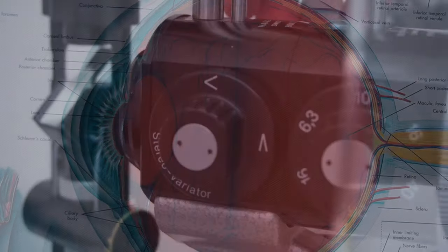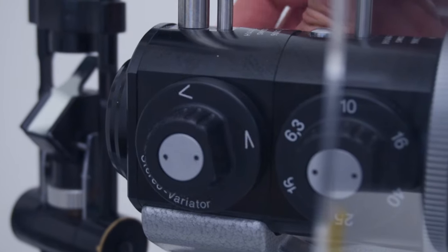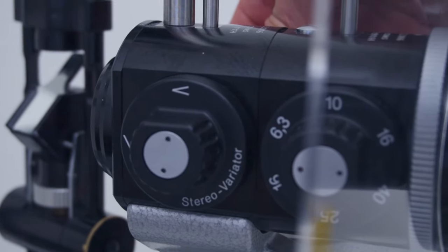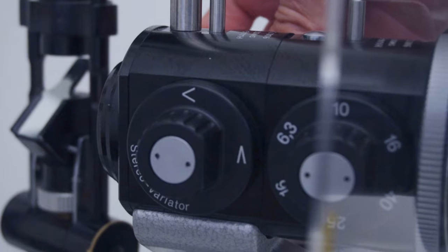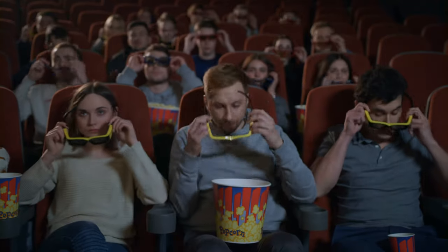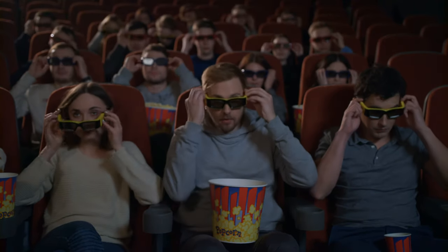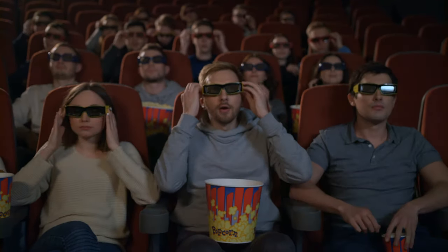Of course using a stereo variator also has its drawbacks. If you've ever been to a 3D movie you know that both your eyes need a slightly different image to see depth. When using the stereo variator you're basically looking at the same image with both your eyes and therefore losing your depth perception.